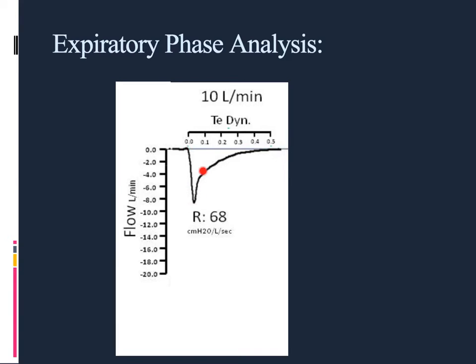So we still have this dynamic flow, and you can imagine that if I'm ventilating at a rate of 60, where I may have even slightly inverse I:E ratios, I want to keep control on this so that I don't have breath stacking or possible breath stacking.